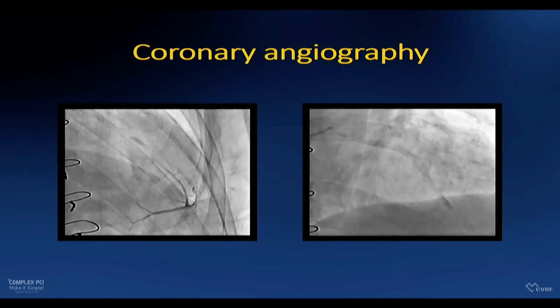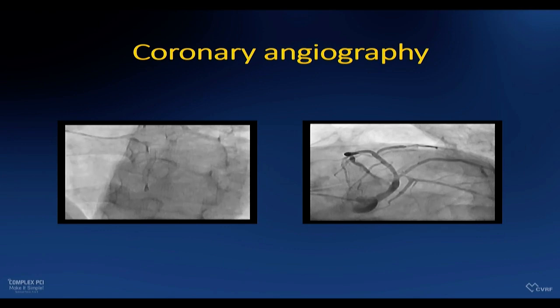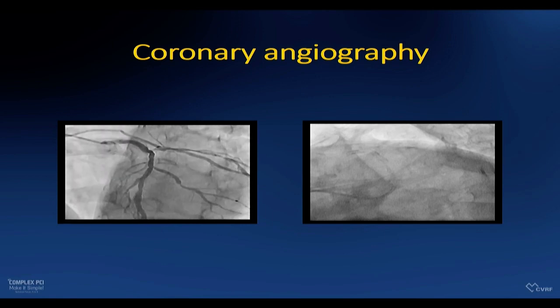Cranial view showing the LAD has mild stenosis. However, the distal left main also shows tight stenosis. And also the angle between the circumflex and the left main is quite steep, almost a reverse angle.